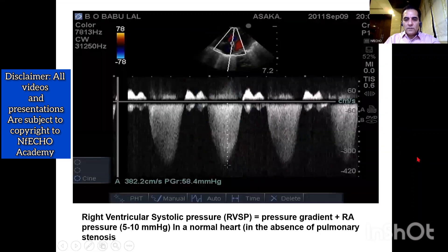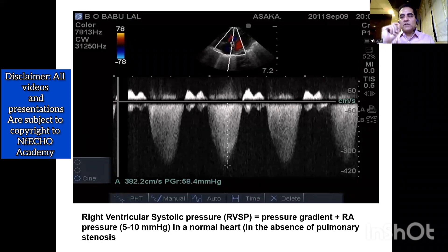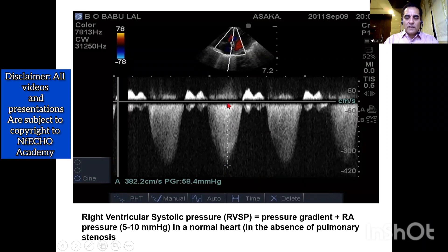You can also see the mitral regurgitation jet here. When I press the continuous wave Doppler button, I will get the tracing of the tricuspid regurgitation jet. As the flow is away from the probe — blue in colour — the tracing appears below the baseline. From that tracing, we need to calculate the maximum velocity, because the machine converts that velocity into a pressure gradient using Bernoulli's principle.